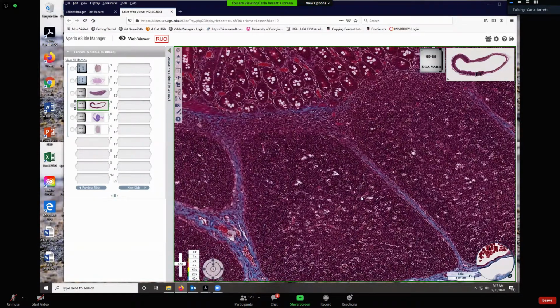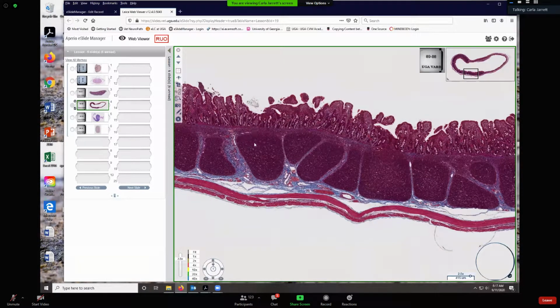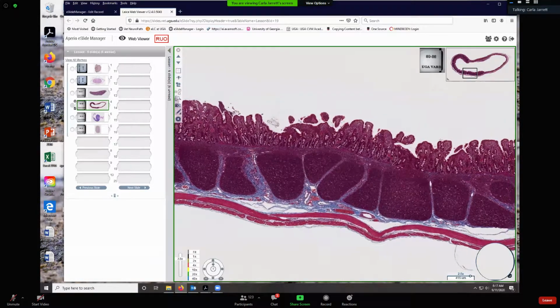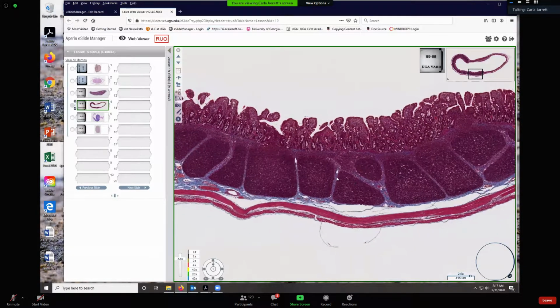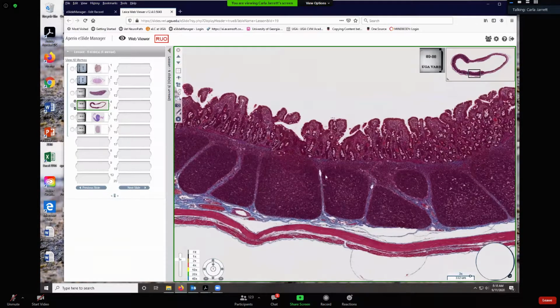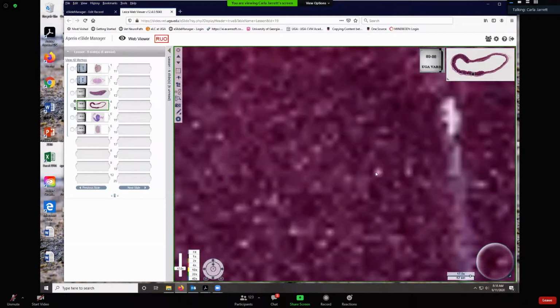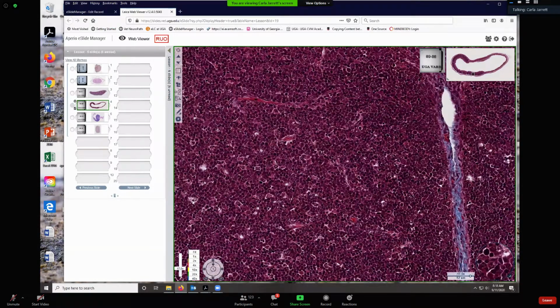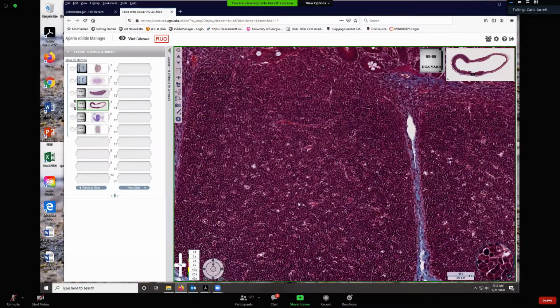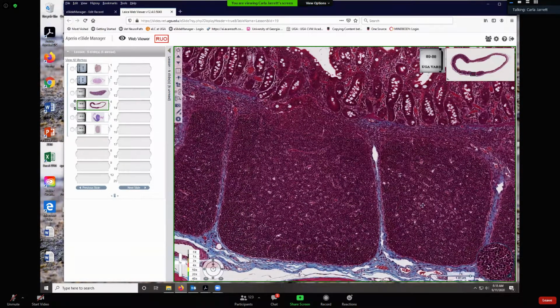These are, let's see, are they primary or secondary? It's kind of hard to tell. Most of them are fairly diffusely, densely stained. So that would be a tough one. I probably wouldn't ask you on an exam whether these are primary or secondary because it's kind of tough to tell. There does seem to be a lot of macrophage activity. We have all these little punched out spaces here. So we know we've got a lot of active macrophages, but I don't really see a well-defined germinal center. So we won't worry about whether they're primary or secondary.